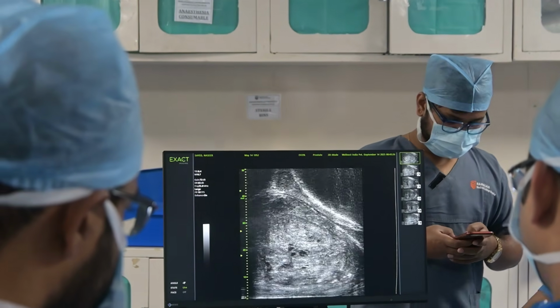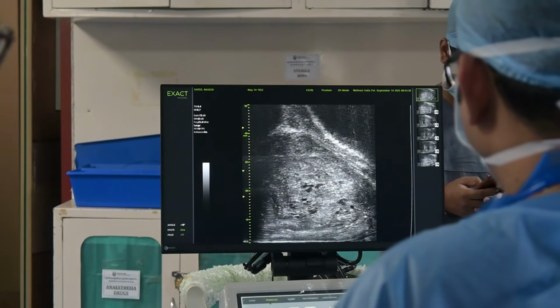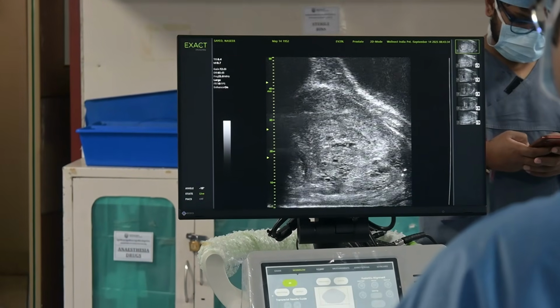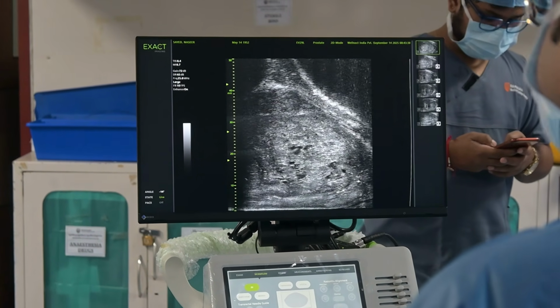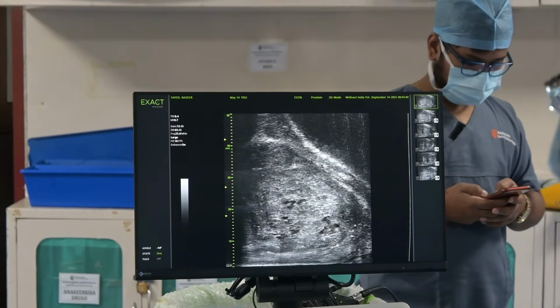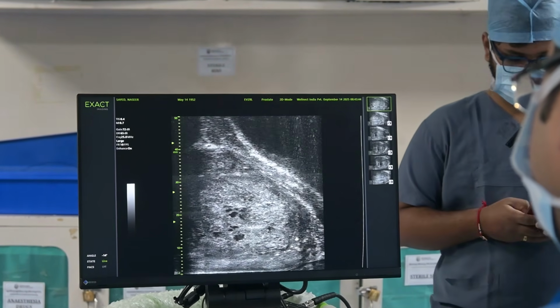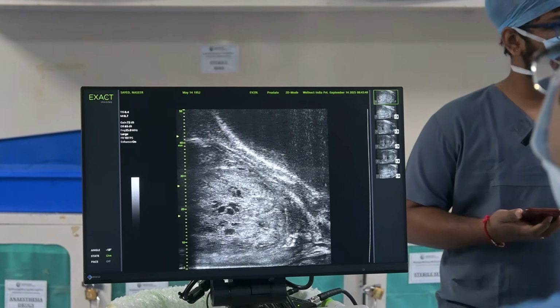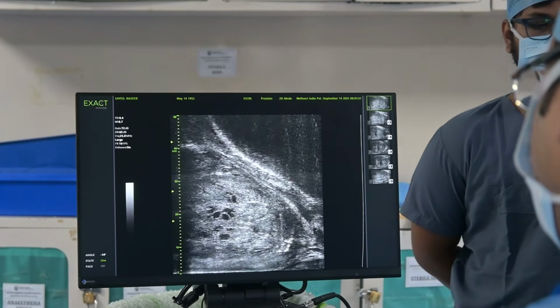Okay, sir. So now again, sir, to the right end of the screen, you will see some ductular patterns. That means you see small black areas interspersed, and these are normal ductular patterns. Below at 6 o'clock, you see a compressed peripheral zone. And now you see at the level of the apex, some hyperechoic area.